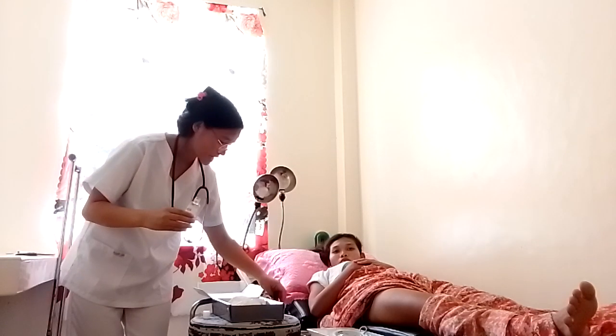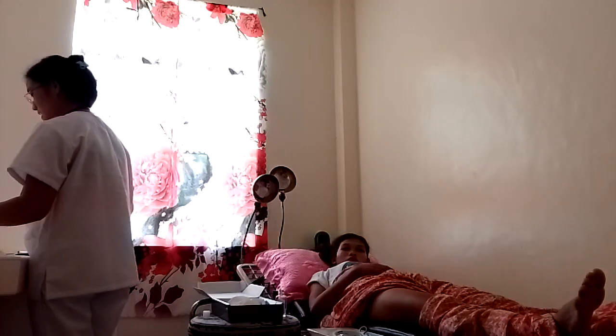Alright. Okay na? And then, after that one, we need to apply sterile gloves. So, magamit na po tayo sterile gloves since maghikap na ta sa samad sa ato ang pasyente. So, karon kay mag-dry dressing na ta, so we need to use sterile gloves. So, I have here the sterile gloves.